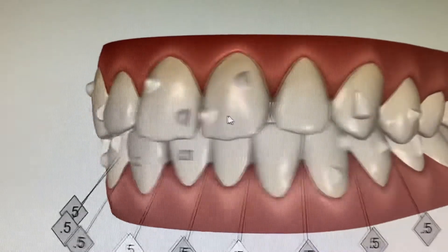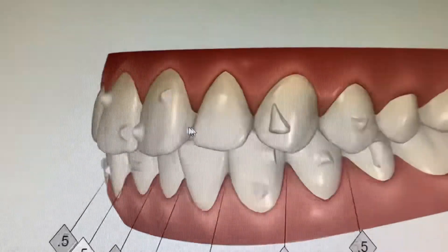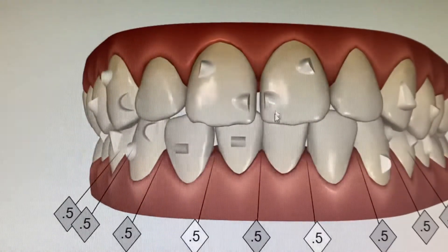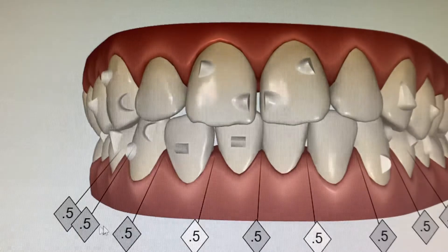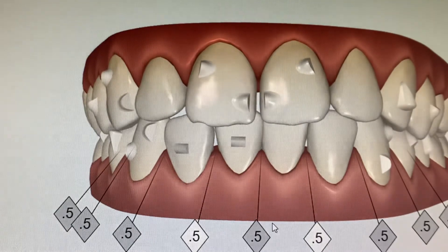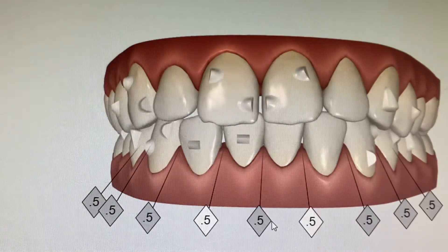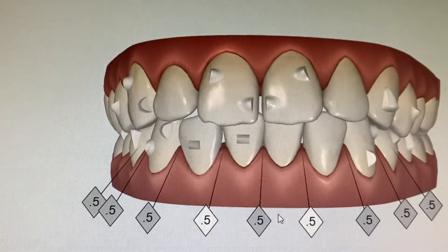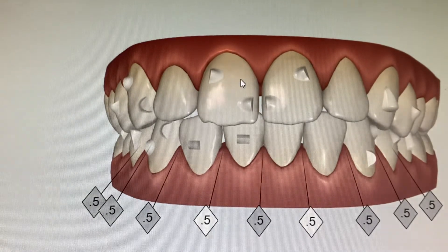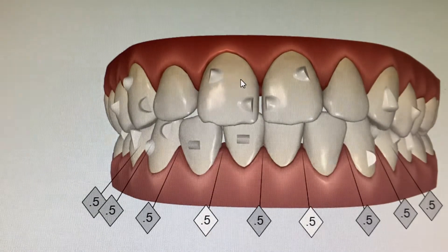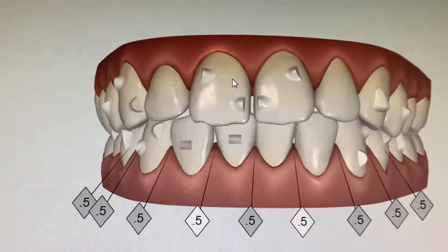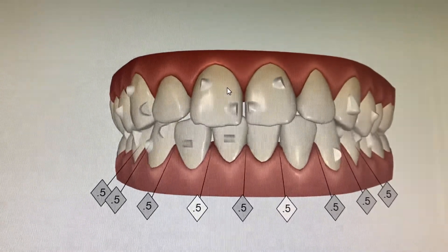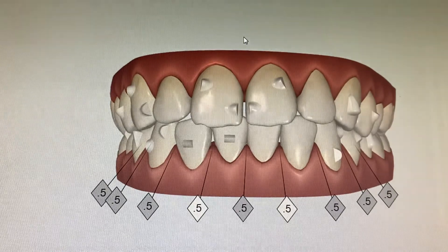We use white and transparent material for the attachments. You can then turn it to see it from different angles. You also see these little numbers here — 0.5 — which means that for this case we're going to polish 0.5 of a millimeter. Your numbers and your attachments will obviously be different to this patient here. This is just an example, but yours will be your actual treatment plan.